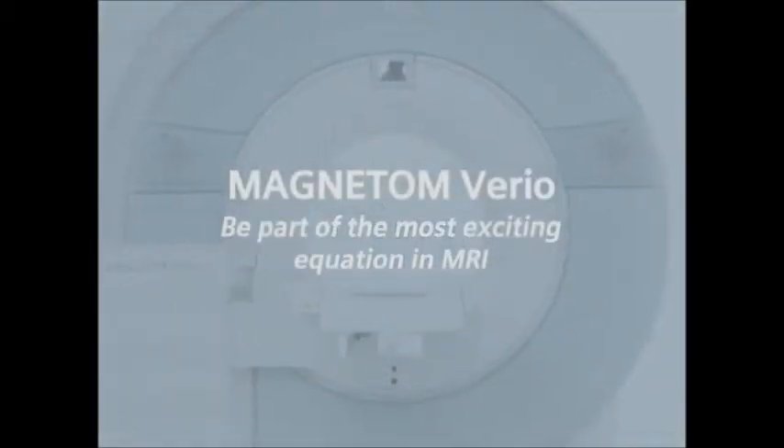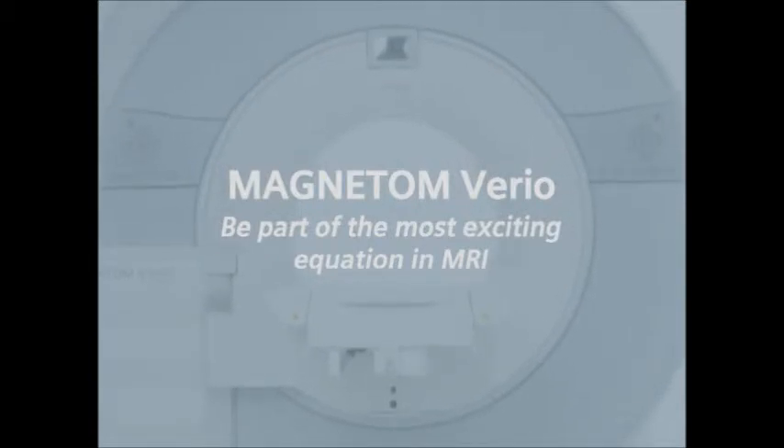It's time to be part of the most exciting equation in MRI.